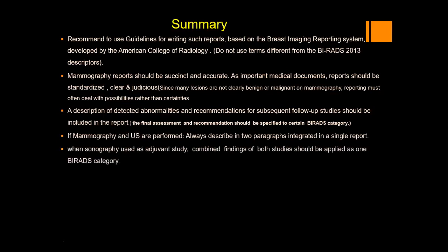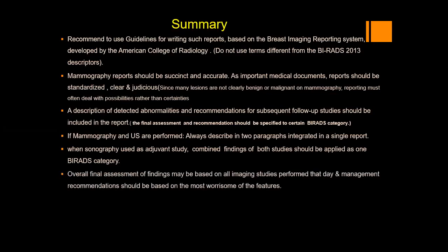But we have to conclude with one final assessment. When sonography is used as an adjuvant study, the combined findings of both studies should be applied as a single BI-RADS category. Overall, the final assessment of findings may be based on all imaging studies performed that day, and the management recommendation should be based on the most worrisome of the features.